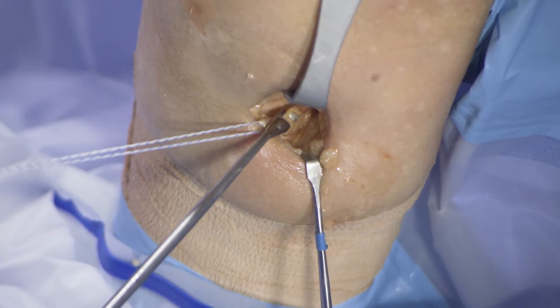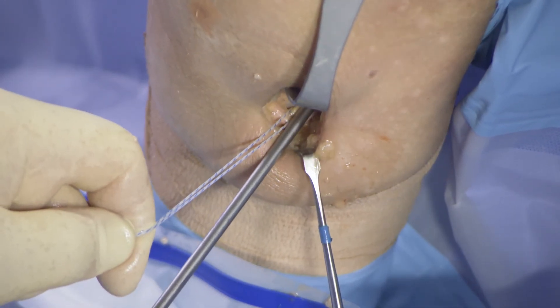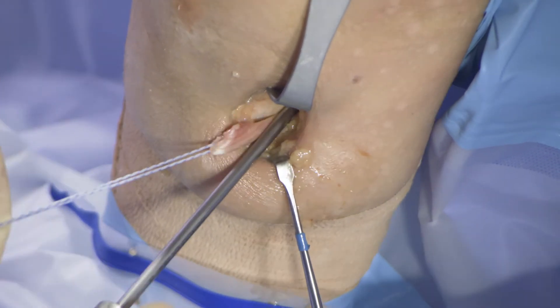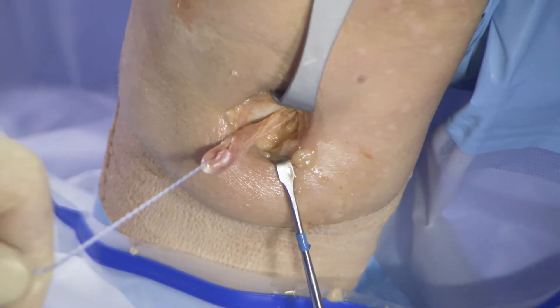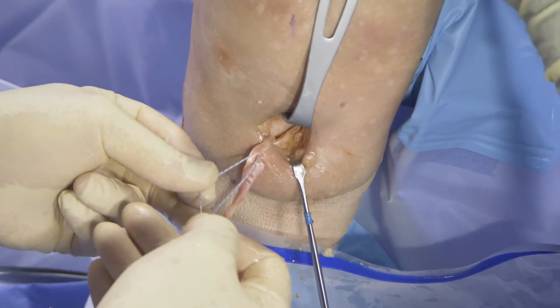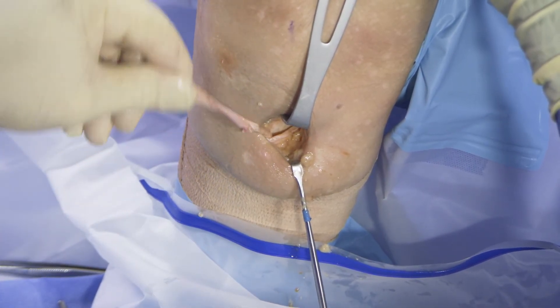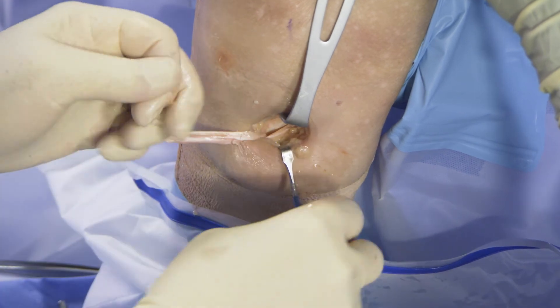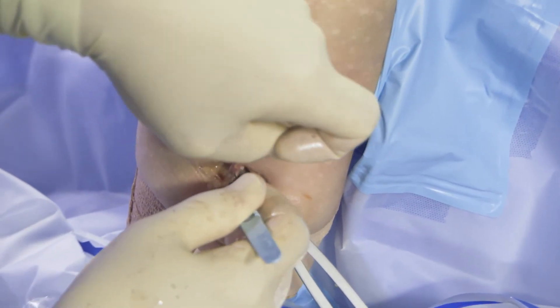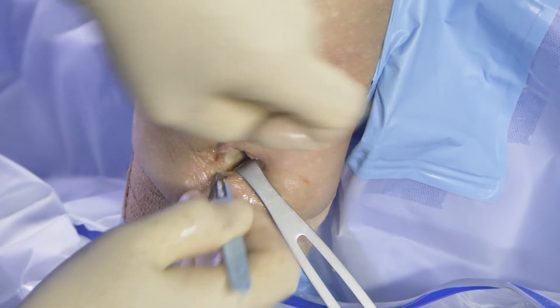This is an open-ended tendon stripper, leaving the attachment on the tibia, and it's slid up the tendon. It's very important not to force it. If you have to exert excessive pressure, you may exit the tendon prematurely, which is disappointing. Once the tendon is pulled out to the wound, we clean the muscular portions off of the tendon, then trace it back to its tibial attachment and remove it directly from the tibia.